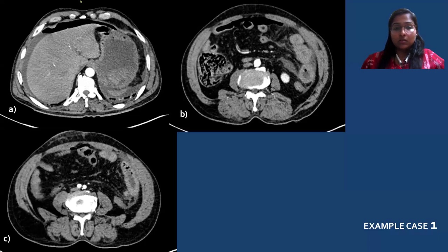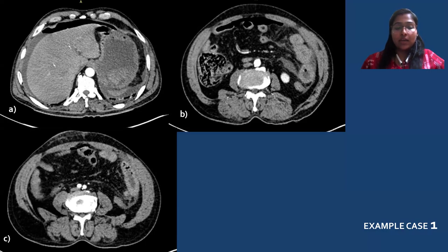This was a case of a 58-year-old male who presented with RTA and blunt abdominal trauma. Free air and free fluid can be seen along the anterior surface of the liver. In the second image, thickened mid-jejunal loops with bowel wall hyperenhancement are visible. In the third image, intramural air can be seen. However, no obvious discontinuity of the wall was visualized, yet intraoperatively, mid-jejunal loops were found to be perforated.